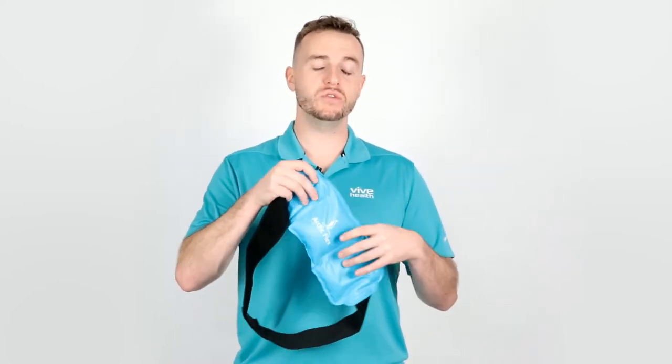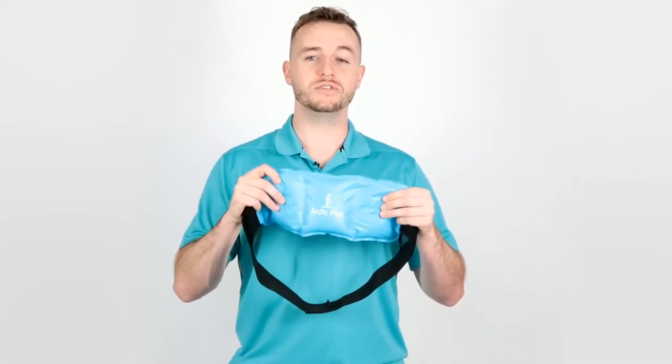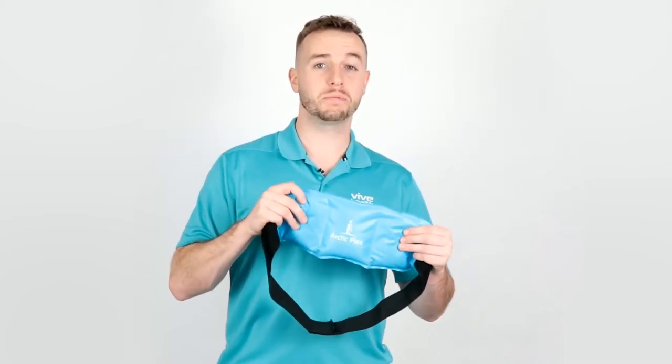It's very flexible when frozen because it's full of a non-toxic silica gel that's super lightweight and durable. And it's also leak-proof.